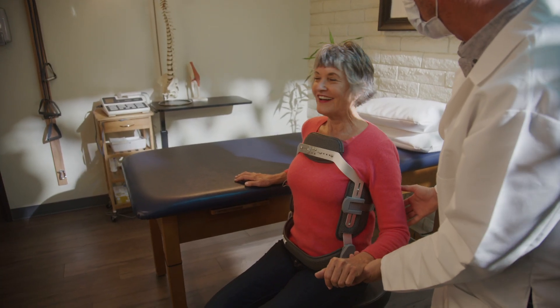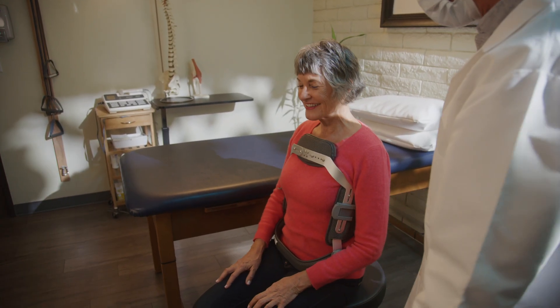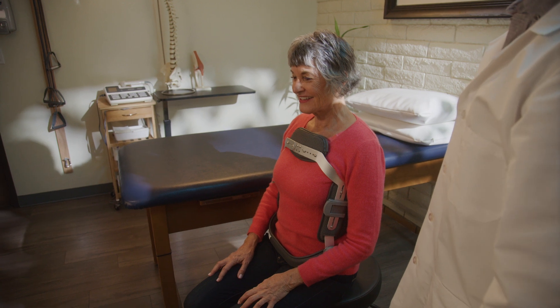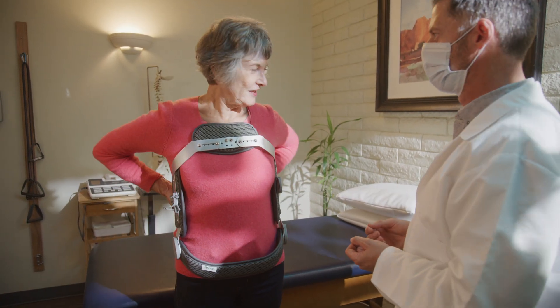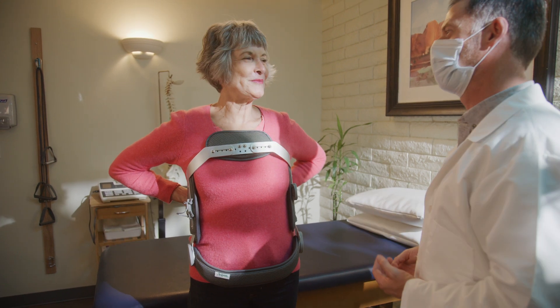The Sierra Hyper Extension TLSO features a personalized fit for all-day comfort and healing. In addition to fitting instructions for the brace, this video also outlines at-home care instructions.